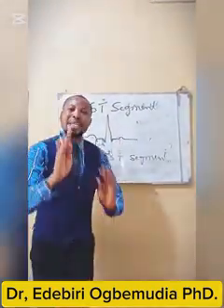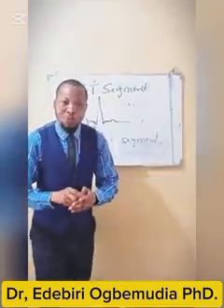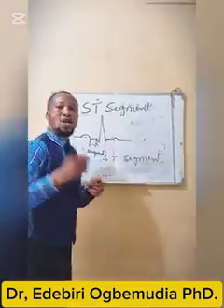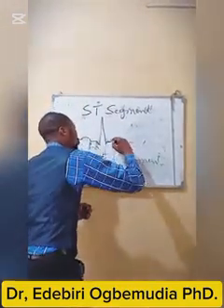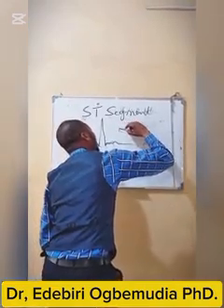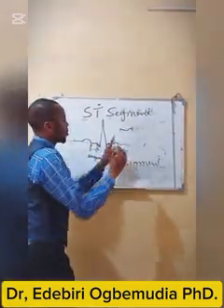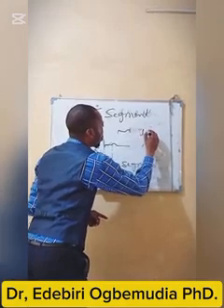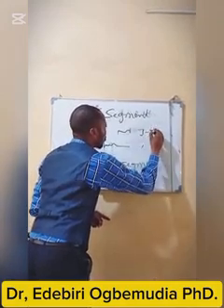In a normal ECG representation, this second isoelectric line is equally called the J junction. You can see J, like something like this. We'll call it the J junction.